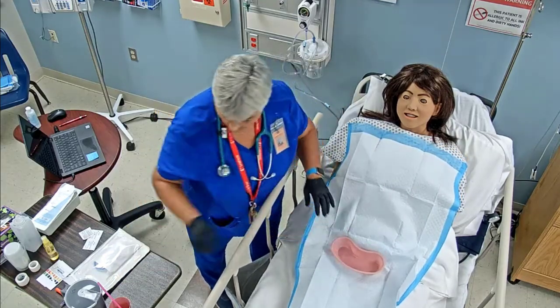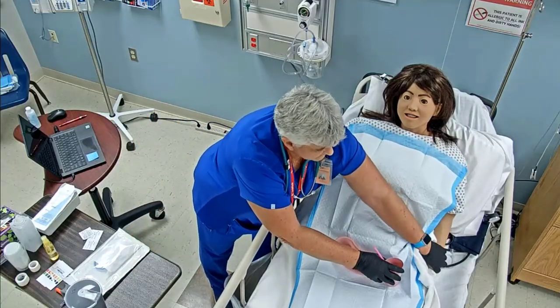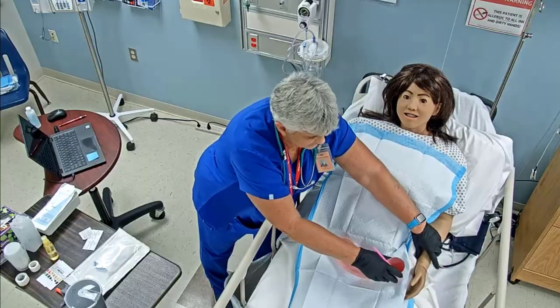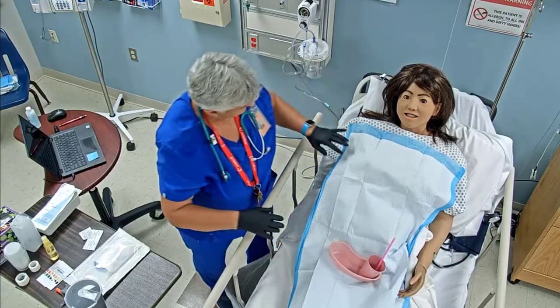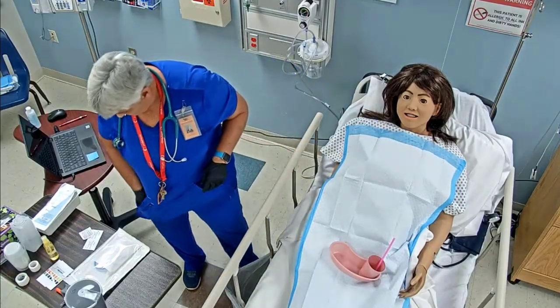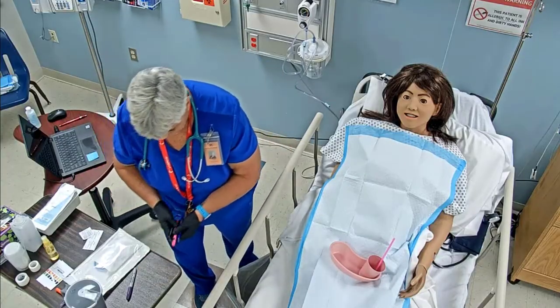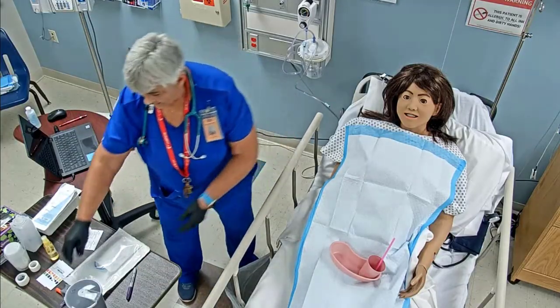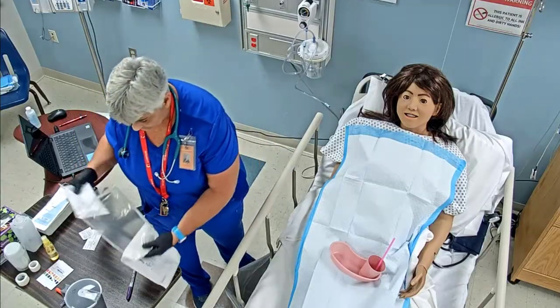I'm going to have you hold that, and then I'm also going to be having you hold your water here, okay? So you're going to hold your water for me. I'm just going to stick it in there right quick, all right? And get my measuring, and I've got my, take my NG tube out.